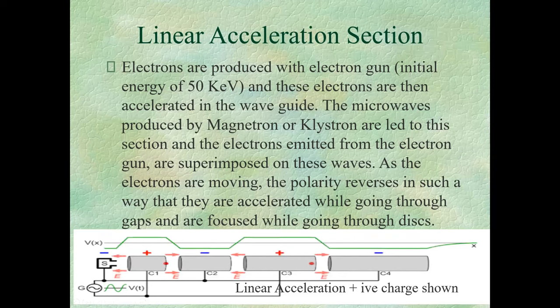If your beam is not hitting the center and it's hitting somewhere else, this will show up on your film and you can talk to the engineer and they can realign these filters for you. So when your beam is not aligned, your flattening filter may be one of the possible culprits. These filters are made of lead. Other material combinations have also been used, like tungsten, uranium, steel, and aluminum. And after the primary collimators, we have the area of flattening filters.